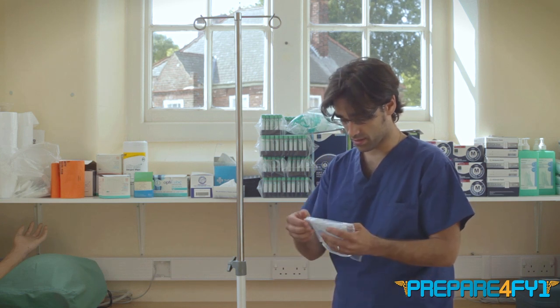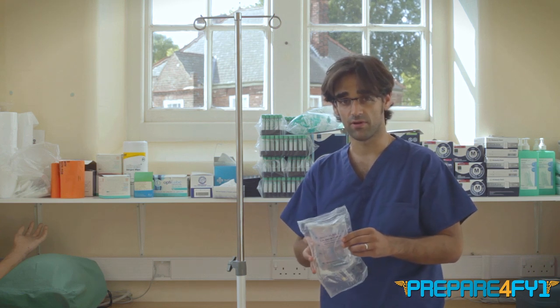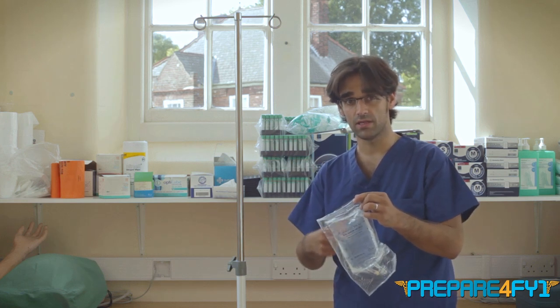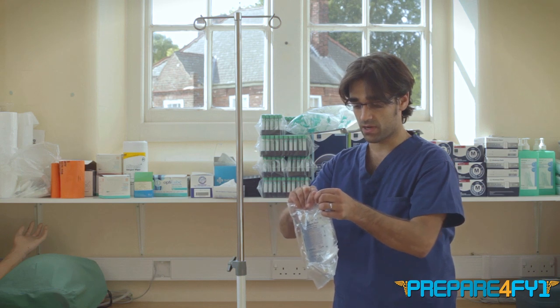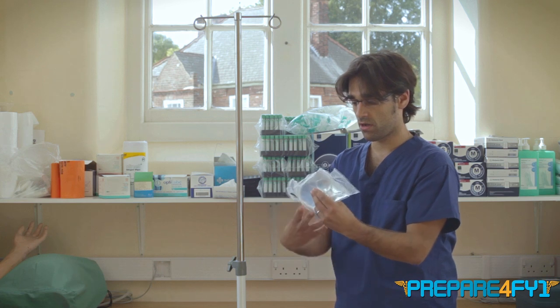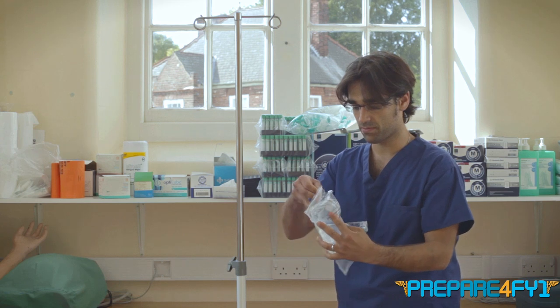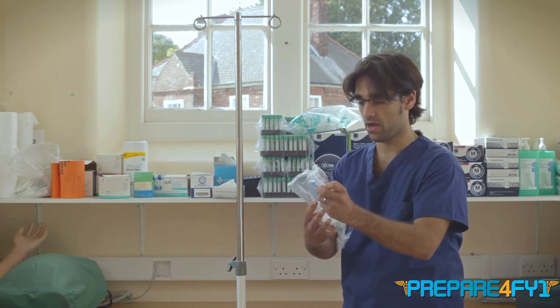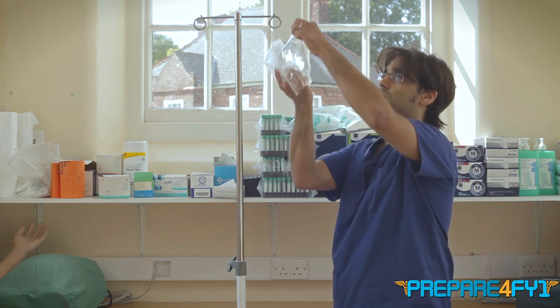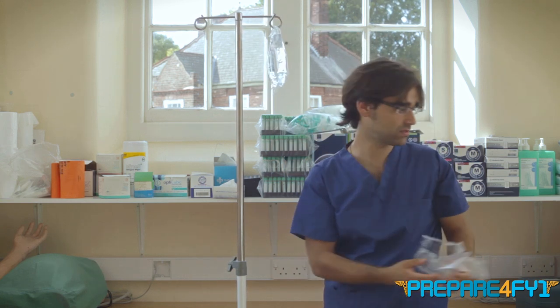There's a tear mark on the top of these bags, and you've got to bear in mind that inside the bag everything is sterile. You can open it in a way that you can hang it without desterilising the bag — that's why I'm doing this without gloves. You tear it, work the fluid out, being careful not to touch the bag inside, and work the bag of fluid out so you can hang the top of it without touching anywhere near where you're going to be connecting the giving set.